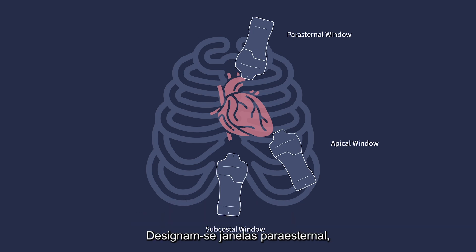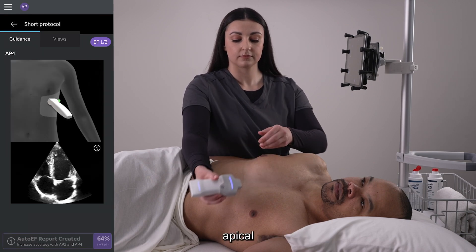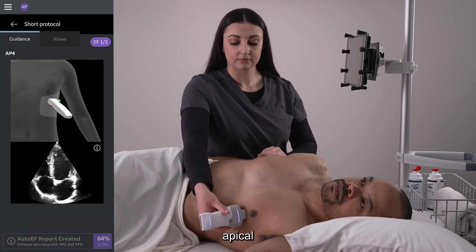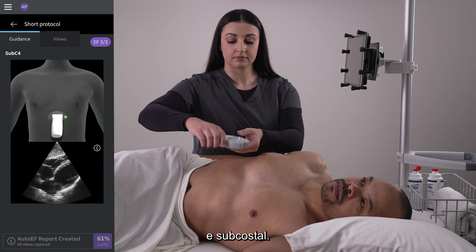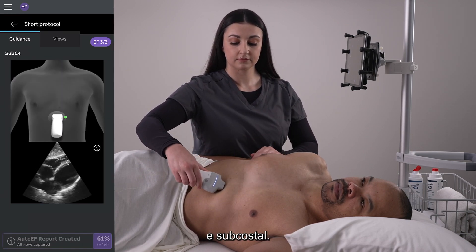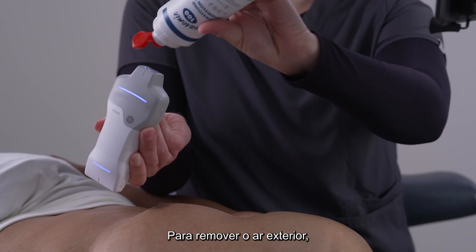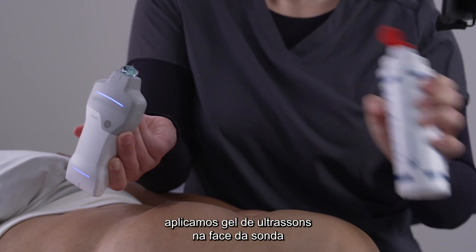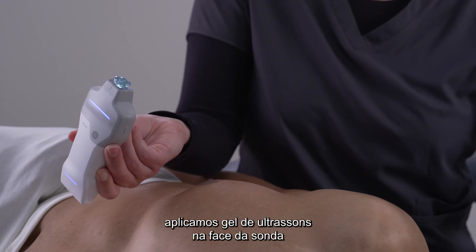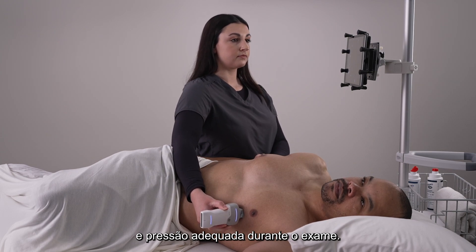They are called the parasternal, apical, and subcostal windows. To remove any outside air, we apply ultrasound gel to the face of the probe and apply adequate pressure when scanning.